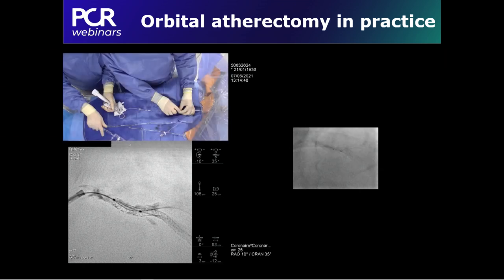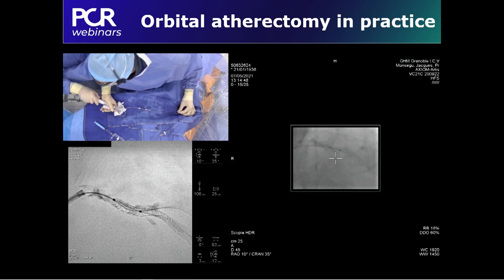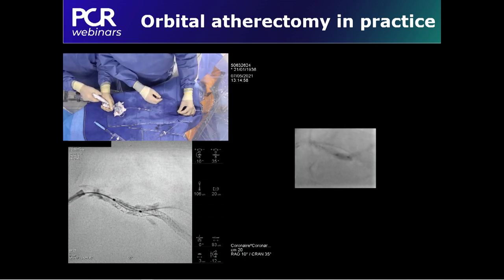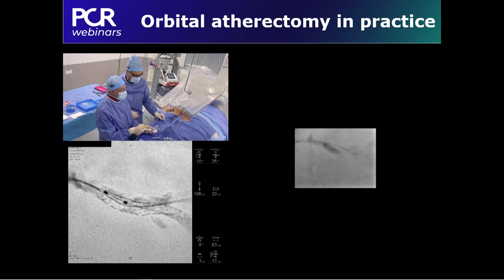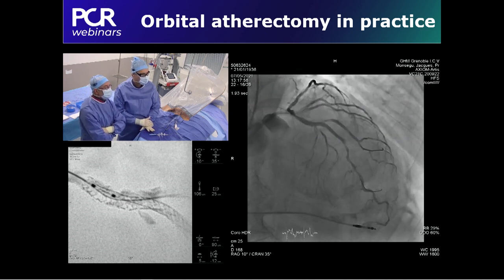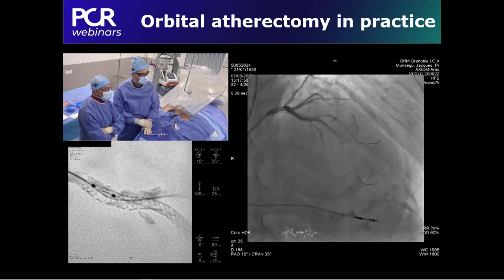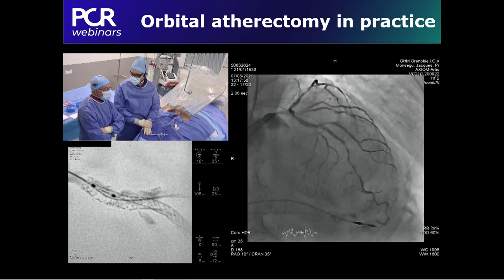We're going to pull back here. Okay, go. We're also going to zoom in order to increase stent visibility. Yes. Go. Okay. Go. 20. Okay. So this is after our stenting. The stent looks fine. The diagonal ostium is a bit hazy, but it's a very patent TIMI 3 flow. We're going to check it with the IVUS.